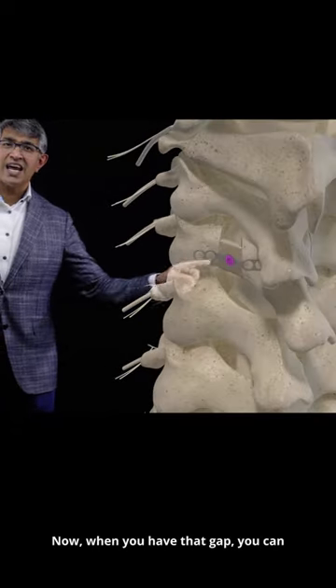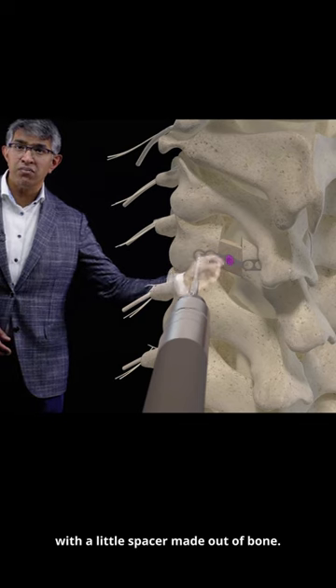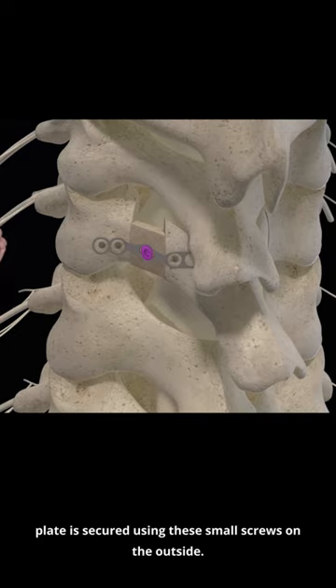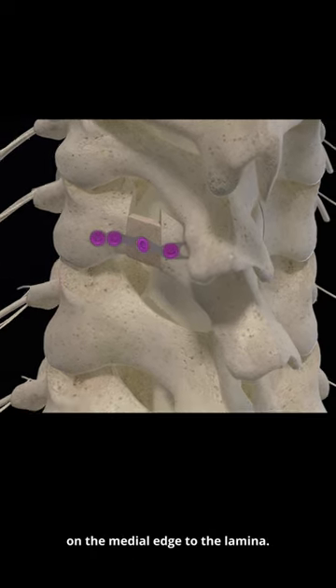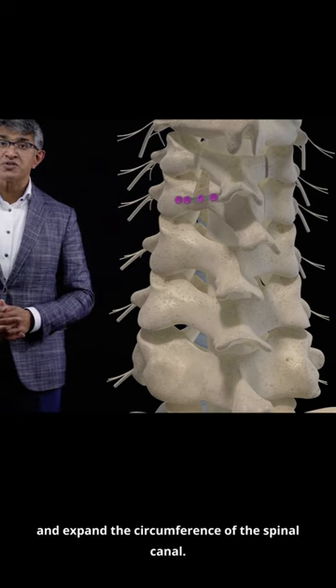When you have that gap, you have to fill it, and I usually use something that looks like this — a little spacer made out of bone. That spacer is applied to a plate, and that little plate is secured using small screws. On the outside it's secured to the lateral mass and on the medial edge to the lamina, and that helps open up and expand the circumference of the spinal canal.